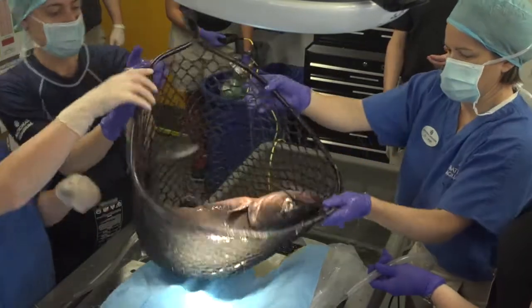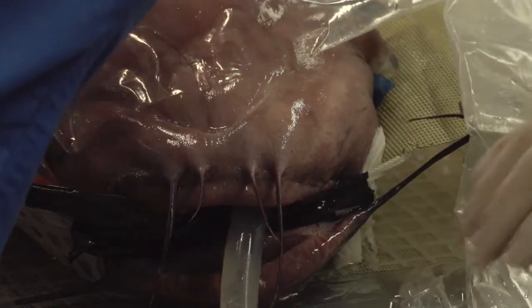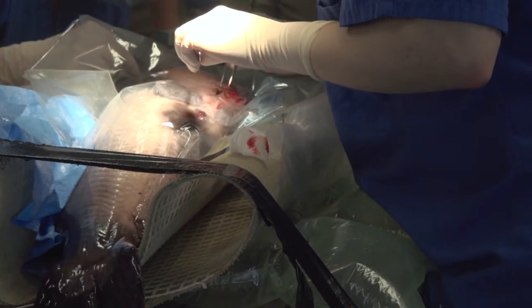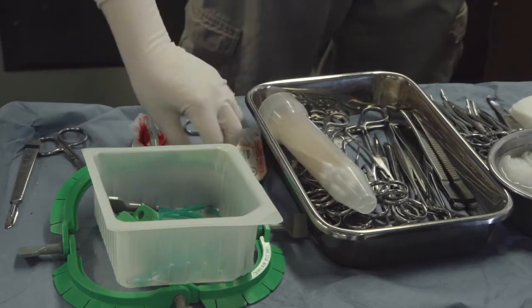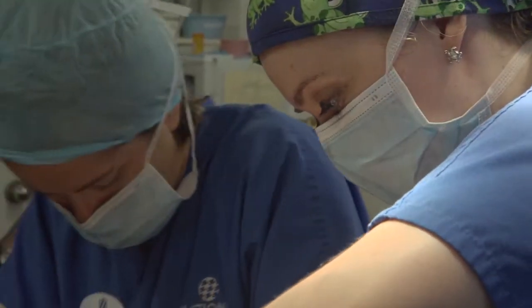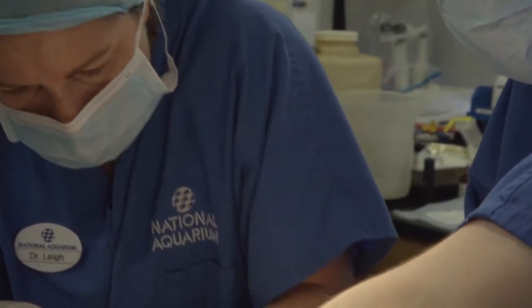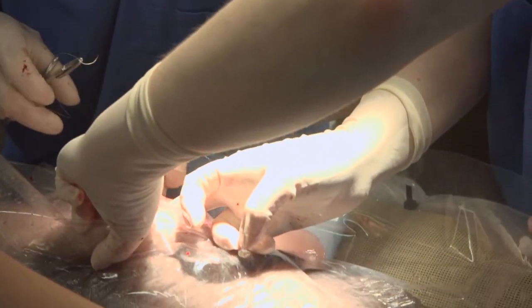Once we get started with the surgery, we move the animal onto the surgical table and start recirculating water over the animal's gills to make sure that they continue to stay asleep. We will use a scalpel blade to make an incision along the midline of the animal and use hemostats and surgical scissors to undermine the different layers of tissue to actually get into the body cavity.